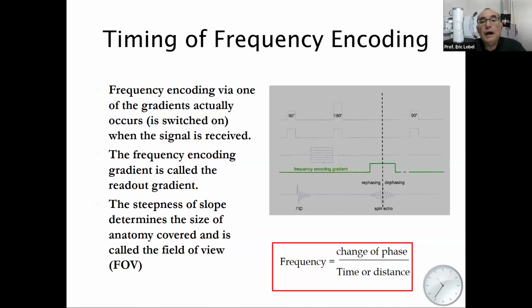And we can see in terms of timing, it's the last thing to happen, right? Here was the slice, here were the phase encoding steps, and the way this is drawn shows you that it's repeating. As I mentioned, once all of K-space is filled, only then will this slice select change its amplitude, indicating that you have a new slice. But generally speaking, the frequency encoding happens third, 1, 2, 3, and notice we're sampling information from this spin echo, not from the FID.